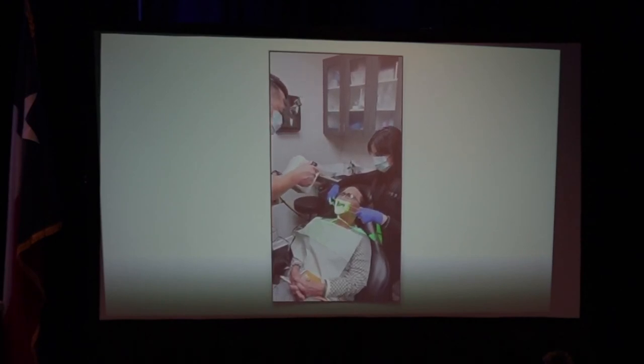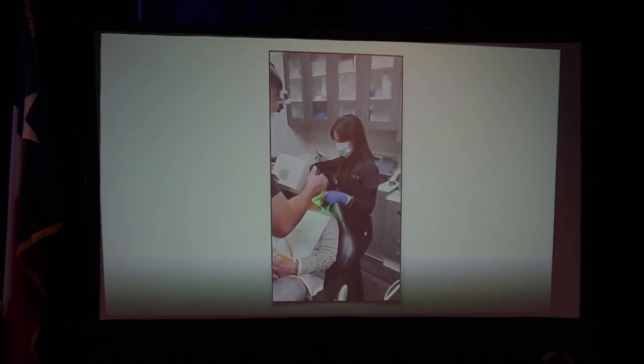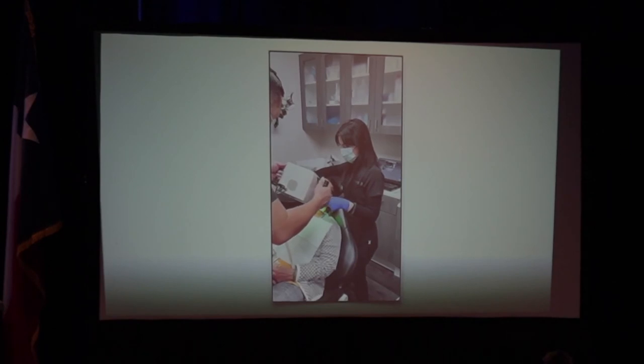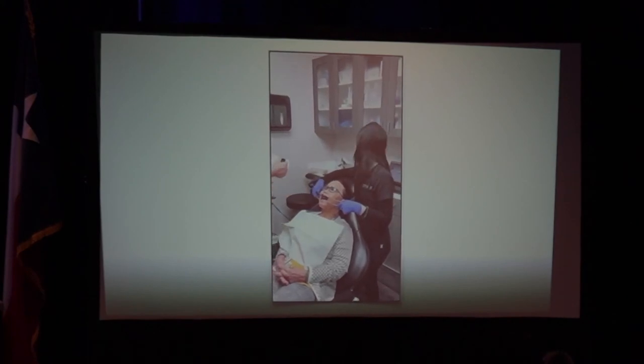This is how you take the scan. It's just panning left and right. So the PIC is designed with those big scan flags. I don't know if you guys have ever seen it, but it's stationary. But we know if you have implants in the back, like pterygoid implants, you're not going to get back there. There was a course recently where they struggled for like an hour to scan a pterygoid case, and they struggled because that's the design there.